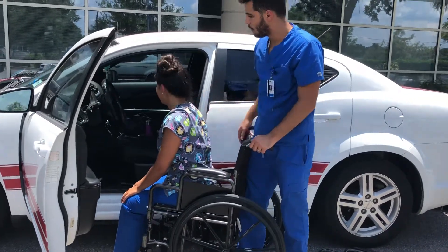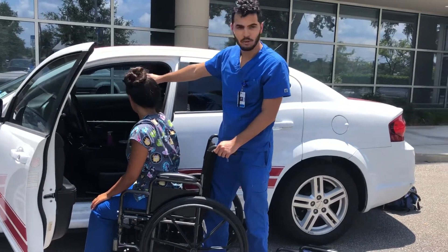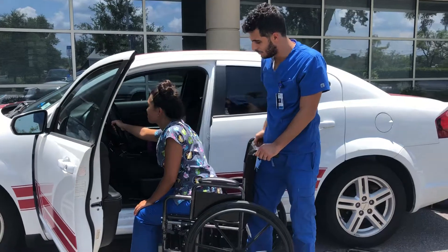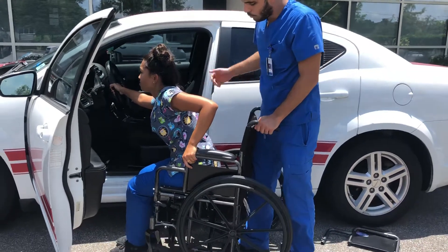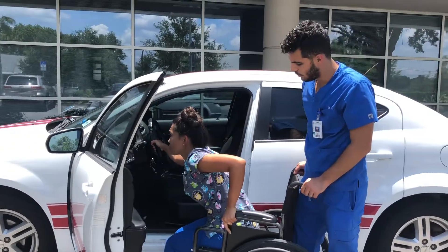With the right hand, you're going to hold either the car seat, the steering wheel, or the dashboard — whichever one you prefer. With the left hand, grab the armrest, and then you're going to pull with the right and push with the left, and you're going to pivot into the car.